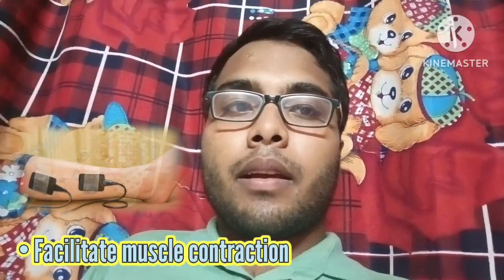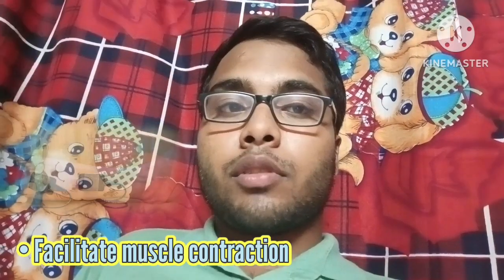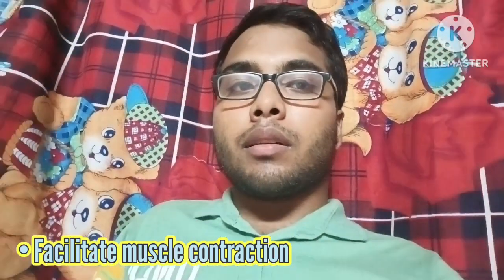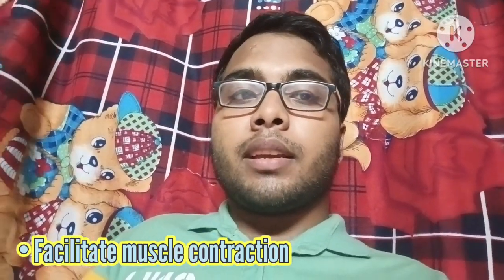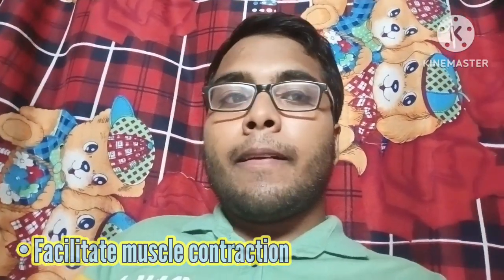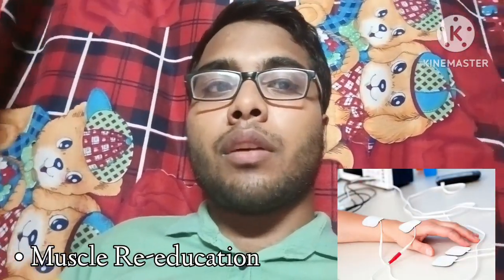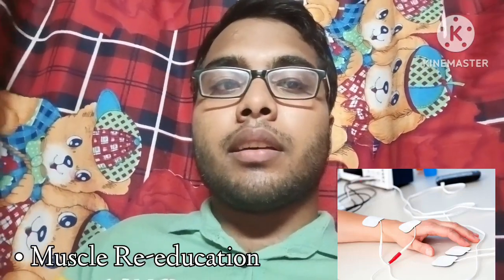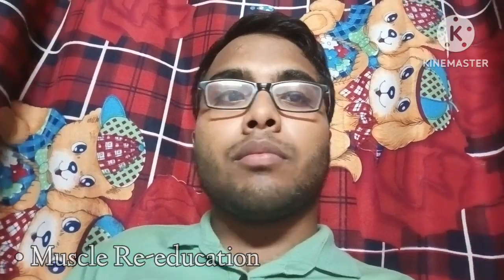So we use the Faradic current as a treatment in cases to facilitate muscle contraction which is inhibited by pain. Suppose you have an injury, so the contraction of the muscle is inhibited by the pain. In that case we use the Faradic current. And also muscle re-education. Muscle re-education means after a long period of disuse of any muscle, we use the Faradic current to restore the sense of the movement.